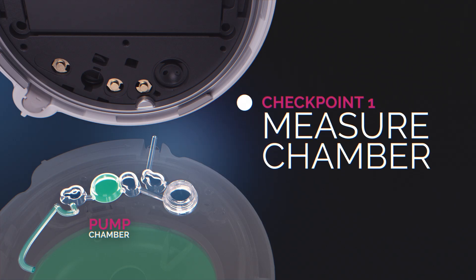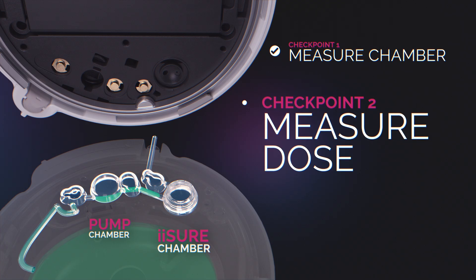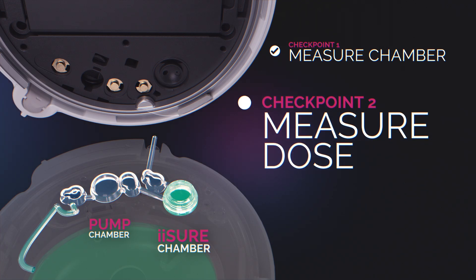First, before the insulin enters the iSure chamber, a measurement is taken to establish a baseline. Next, the iSure chamber is filled with insulin and sound waves from the iSure sensor measure the volume of insulin.